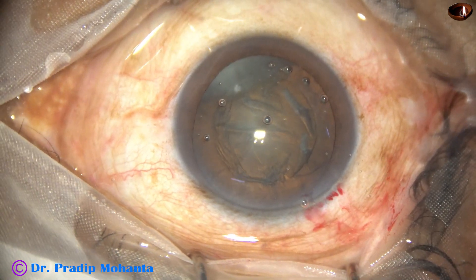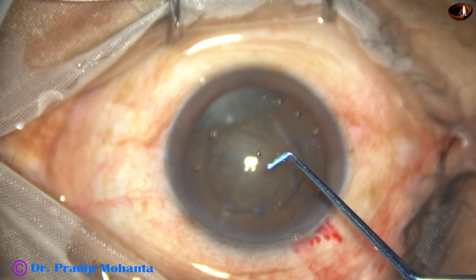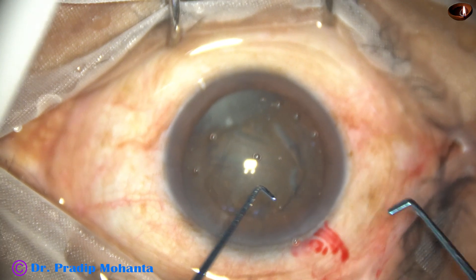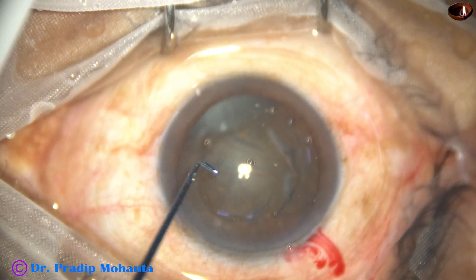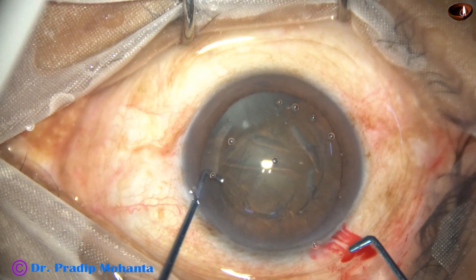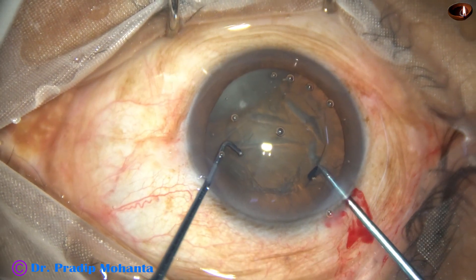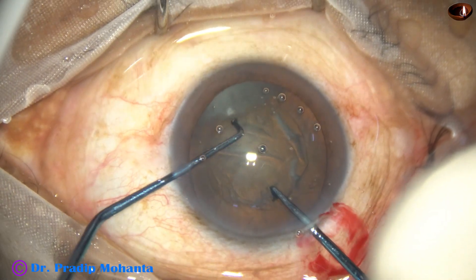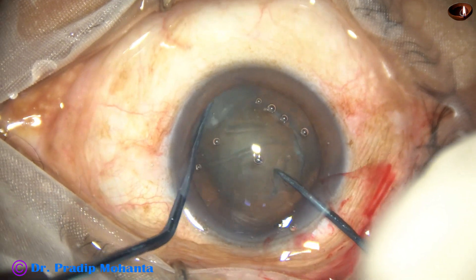This is the first one. After hydro-dissection and nuclear rotation, the anterior chamber is filled up with visco. Now the pre-chopper is taken in the right hand and the sustainer in the left hand — pre-chopper in the dominant hand and sustainer in the non-dominant hand. The sustainer goes first, then the pre-chopper. It engages in the soft part of the nucleus just in front of the main wound, just adjacent to the anterior capsular rim.